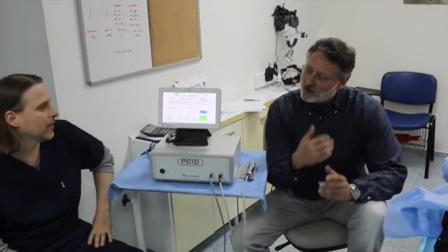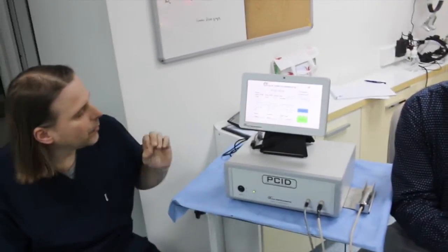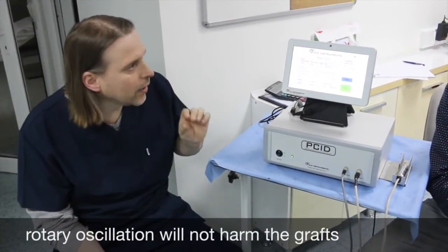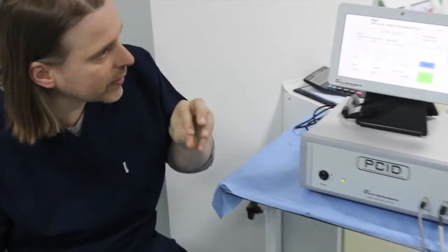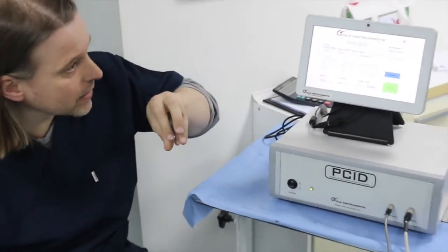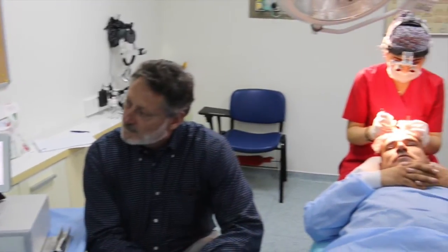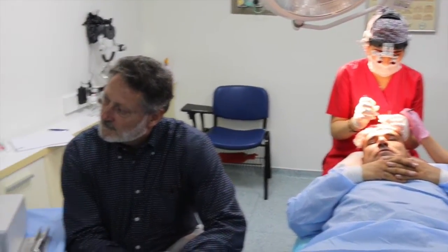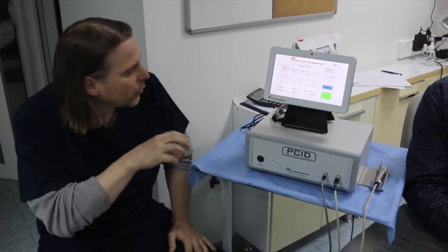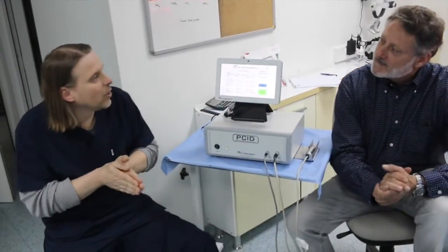I noticed today you went through a number of different programmable protocols. Would you explain what protocols work best for you? The best protocol for me is to work with rotary oscillation — an initial very short rotation to cut through the epidermis, and then you dissect the tissue bluntly with tiny oscillations in an angle of 100 degrees, scoring through to a certain depth. You have depth control as well, and you can also adjust the rotations or oscillations per minute — lower them or raise them. You can imitate the manual effects but with much less fatigue.